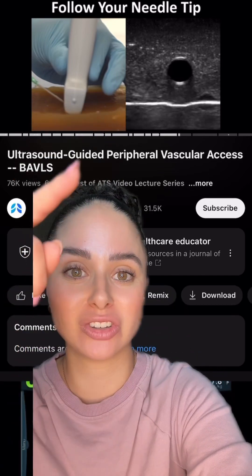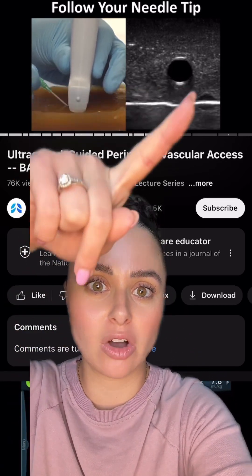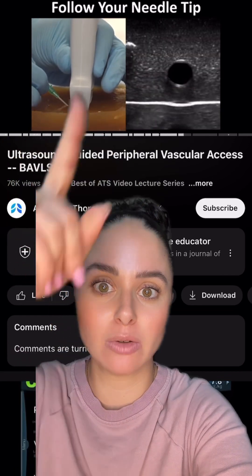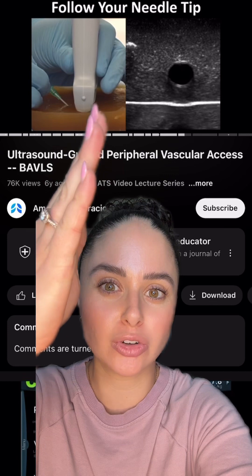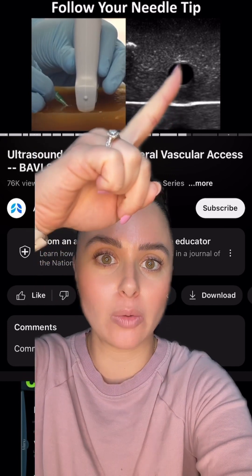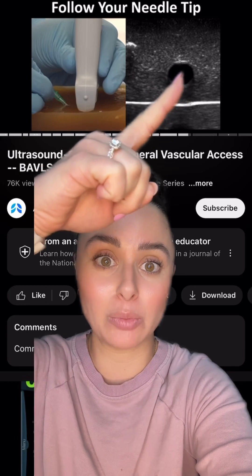You should actually be able to see the needle tip coming down on the ultrasound. You can slide your ultrasound as you're advancing the needle so that way you can follow that glowing tip, and you should actually be able to see when that needle pokes through the vein.